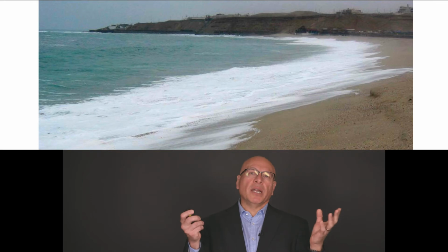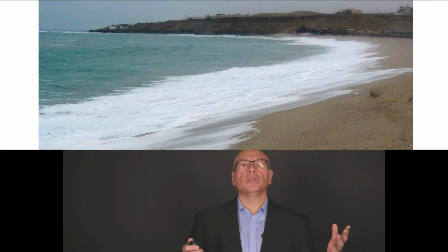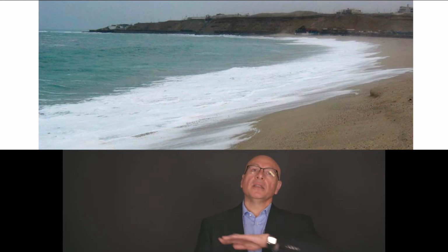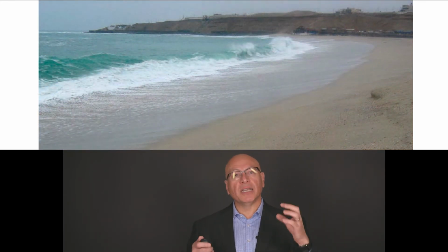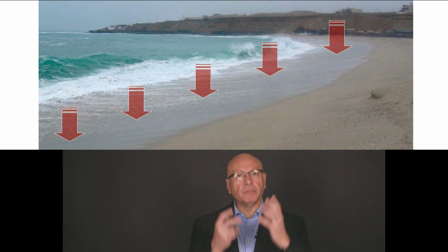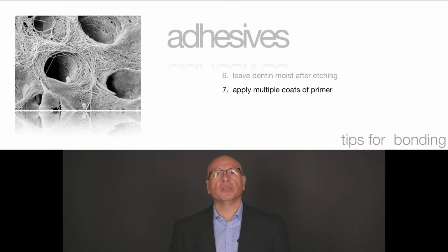The best example that I can tell you, that I heard from Joel Berg from the University of Washington, is: think about the beach. The wave comes in, wets the sand, the wave recedes and leaves this moist sand. So think about your cavity preparation before you place your adhesive: leave it moist like the wave just receded, like wet sand pretty much.